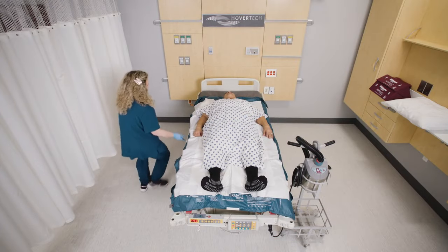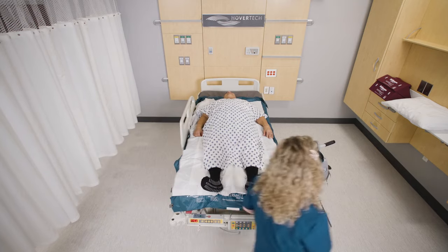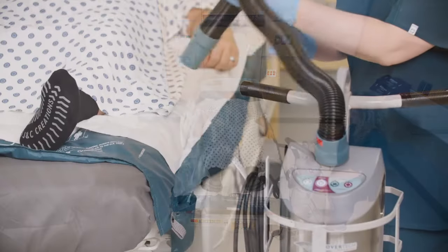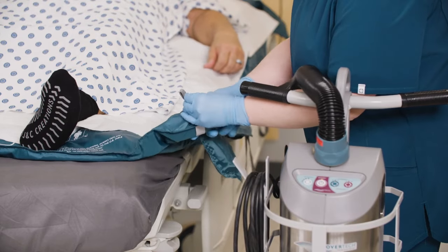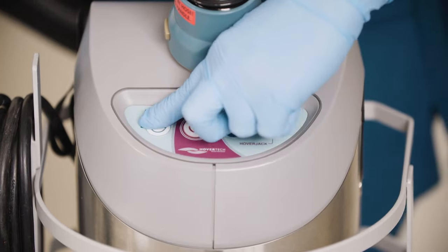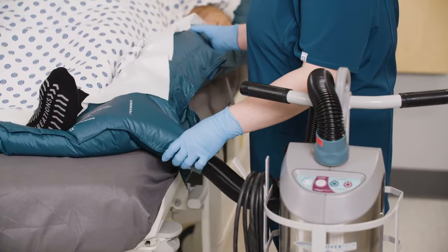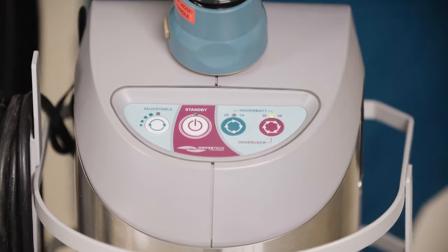If using one caregiver, raise the side rails prior to mat inflation. Place the air supply at a convenient location. Insert the hose nozzle into either of the two hose entries at the foot end of the Pro's AIR and snap into place. Press the variable speed button to ensure the patient is centered. When confirmed, press the 39-inch hover mat setting on the air supply.